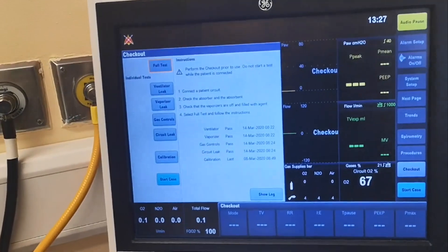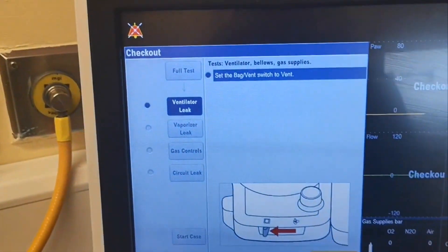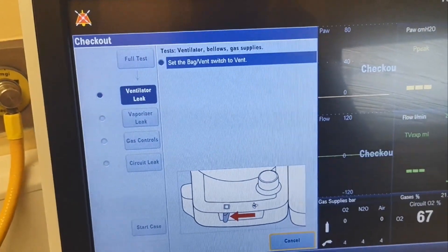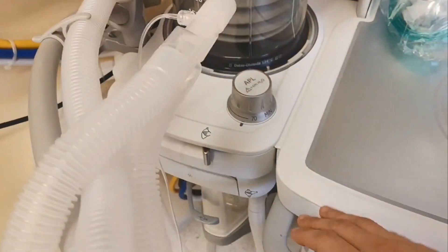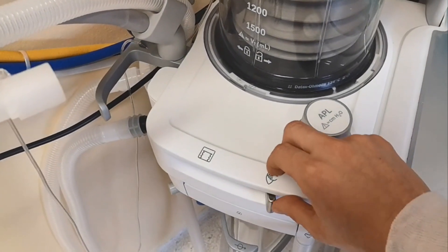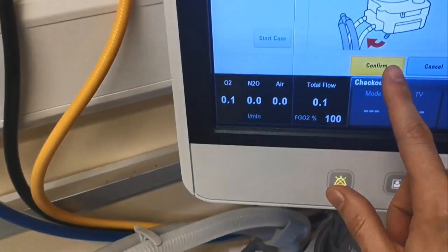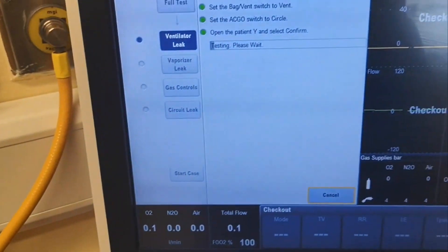All right, as usual first thing: full test. Set back to vent — the switch in this machine is here, so we put it to ventilator. Open the Y — Y is open. Select confirm, start screen.